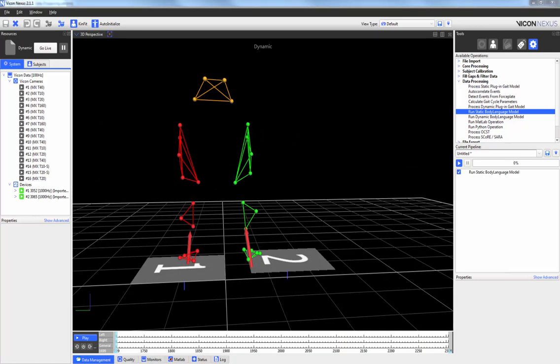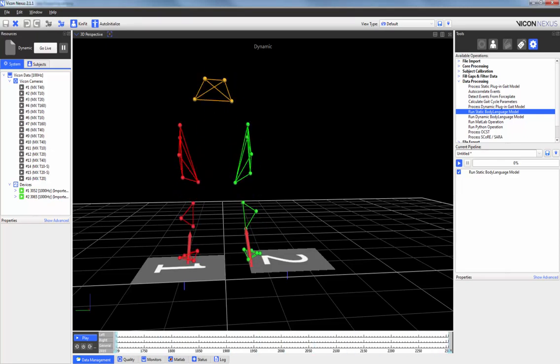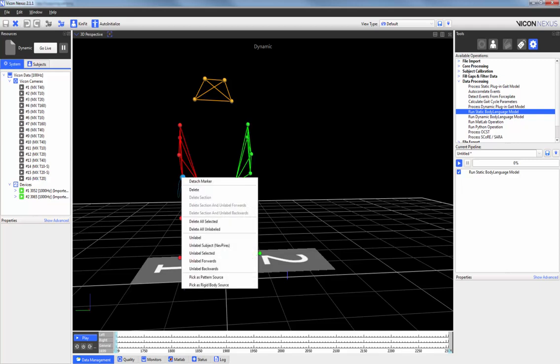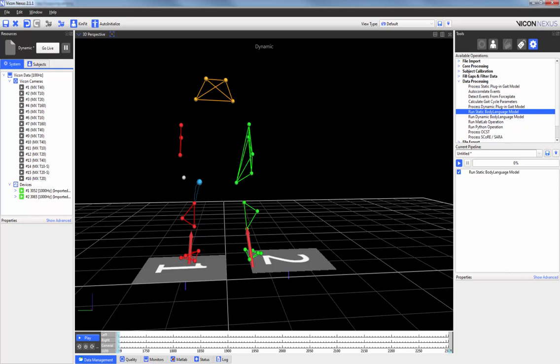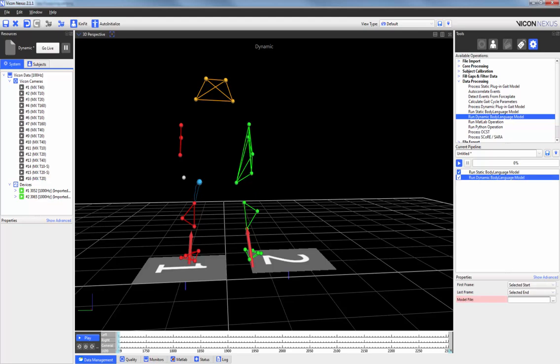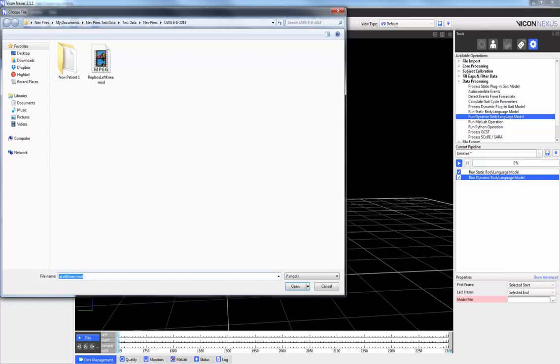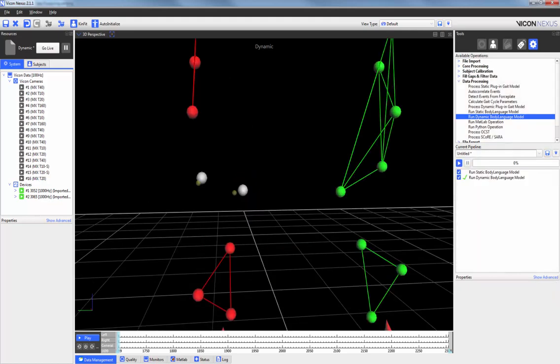After saving my static trial, I've loaded my dynamic trial, which is simply my subject squatting. I'm going to unlabel my two knee markers to show you where the modeled markers will be recreated. I'm now going to add the Run Dynamic Body Language Model to the pipeline and load the same model file. When I execute this operation, we can see that the model markers have been created where the original markers were. Just like the original trajectories, we can plot and export the new modeled markers.